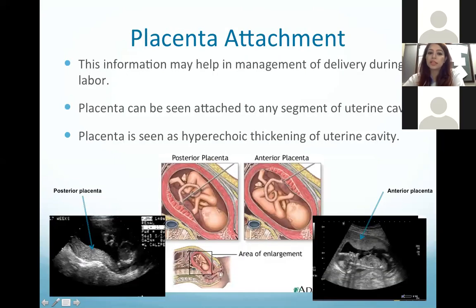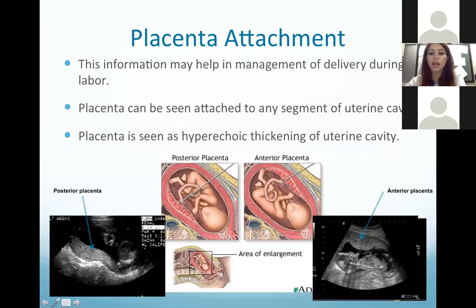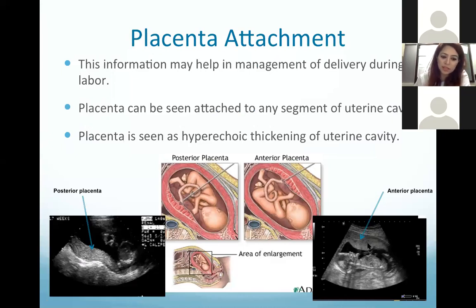Now regarding placental attachment: placenta can be attached to any segment of the uterine cavity and appears as hyperechoic thickening of the uterine wall. This information is important for delivery management, as a low-lying placenta requires cesarean section. Here you can see an ultrasound image showing a posterior placenta, and this is an anterior placenta — the placenta just below the abdominal wall is anterior, while the one away from the abdominal wall is posterior.